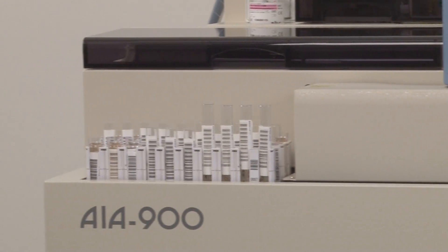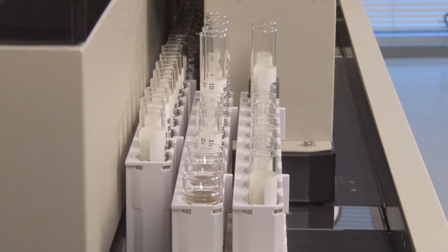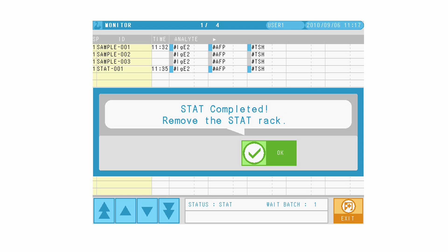Stat samples designated on the work list will be processed with highest priority. Once stat samples are processed, routine operation resumes automatically with no intervention from the operator. Stat results are listed in a separate window for easy review.